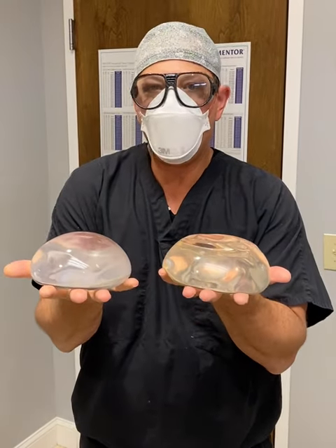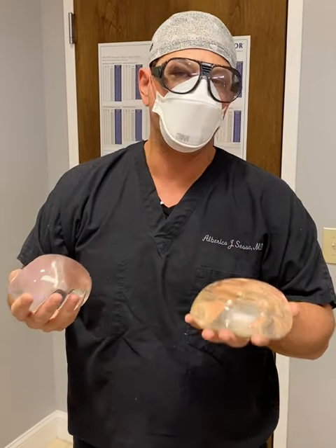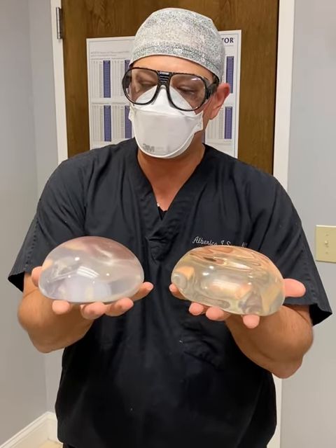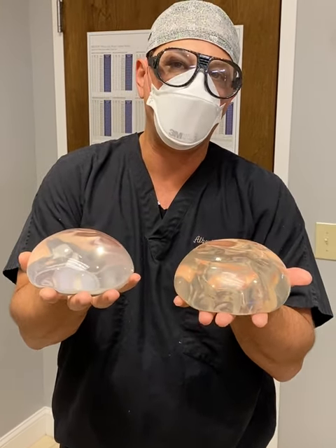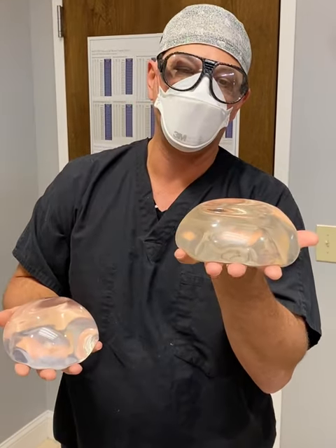So depending on whether you have a narrow chest, wide chest, or a long chest — depending on your particular dimensions — either one of these would work better. Here at Sarasota Surgical Arts, that's the reason why we try these on, because there's no way to tell until you actually try them on and look at them to see whether you like the look of one or the other.